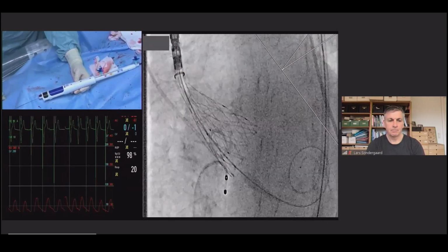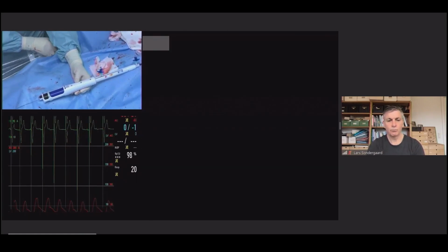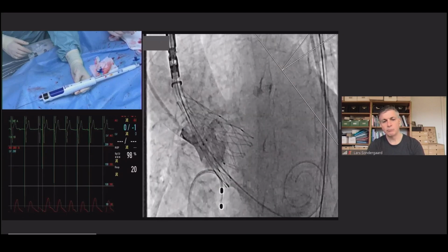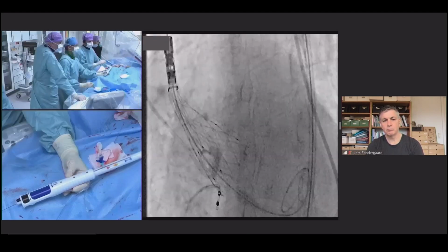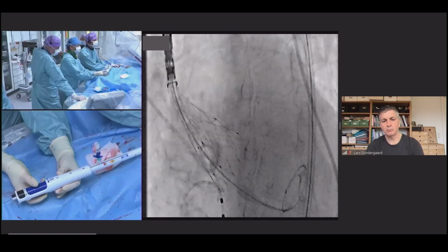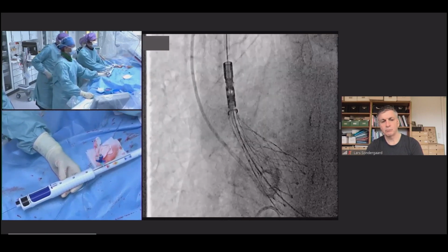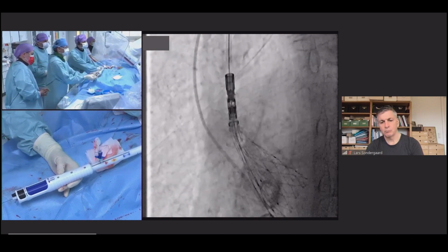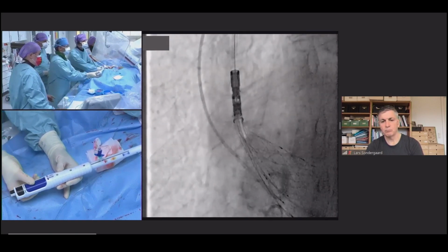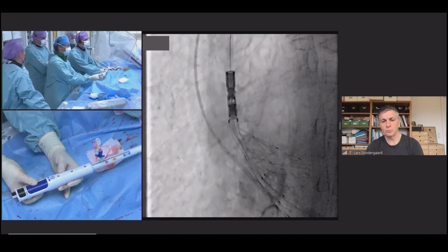So now here, as always, it's important when you implant in this cusp-overlap view to confirm in this view that you're actually below the aortic annulus. Yeah, so we can just see the top here. Now, if you pull the stiff wire a little bit back, let's move on. Let's give some backup pacing, please. Yeah, 80. So I go further to release. We are in agreement, yeah?